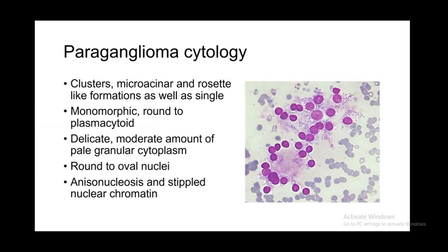Paraganglioma cytology many of us would not be familiar with, because this is mostly a radiology diagnosis, and paragangliomas are usually not aspirated for fear of hypertensive crisis. But thankfully, this patient who had FNA twice did not suffer any complications, because this was a non-functional tumor.